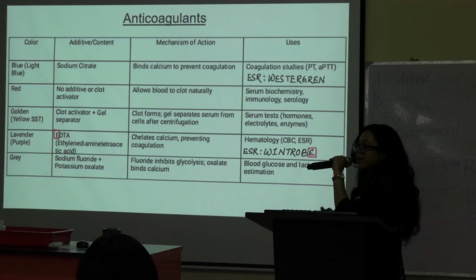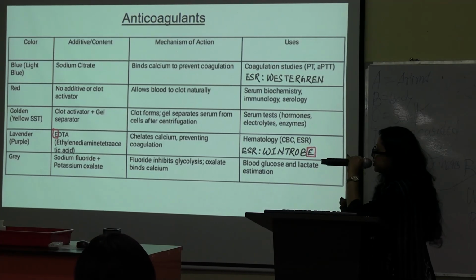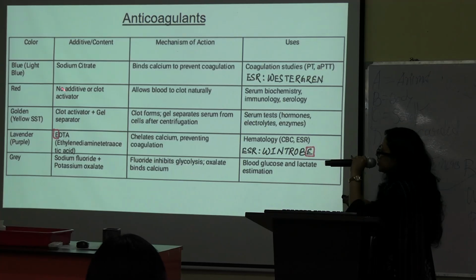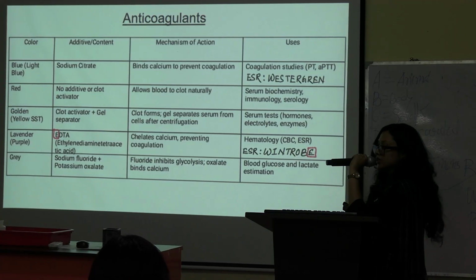So the mechanism of action is chelation of calcium. So everyone, the mechanism of action is chelation of calcium. And another point to remember that this red one and golden one doesn't contain any anticoagulant.